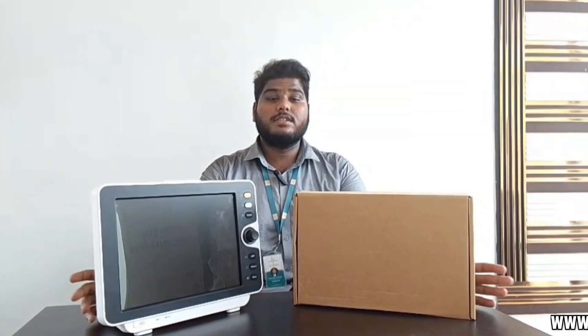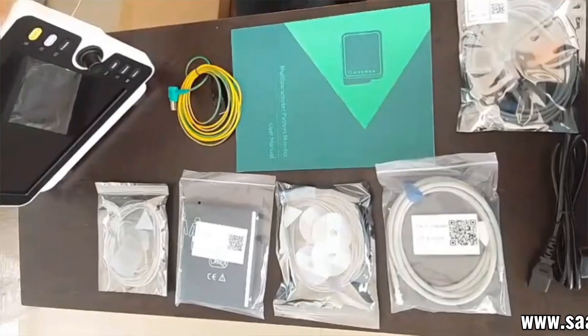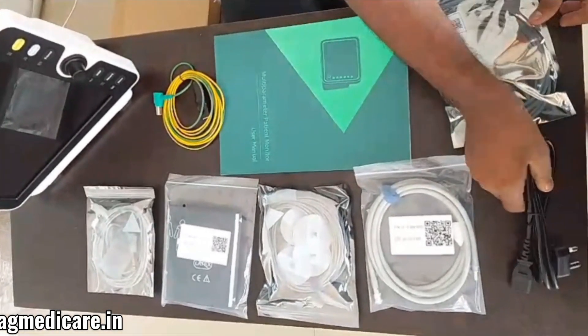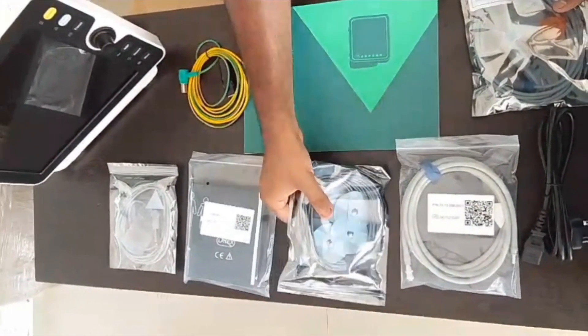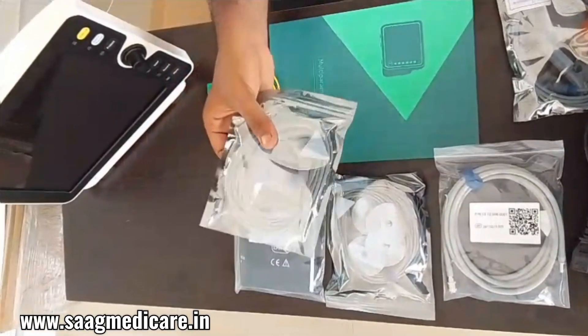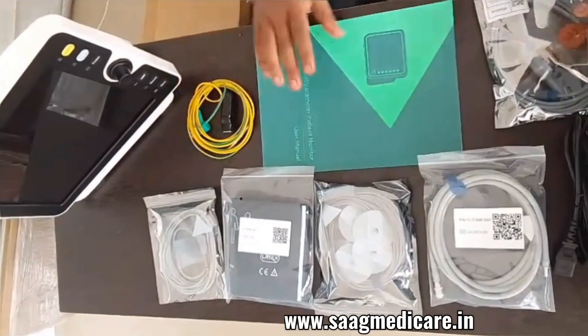Without any further delay, let's move on to unboxing and we can see the device specifications. This device comes with an SPO2 sensor, a power cord, an ABP cable, ECG cable along with electrodes, an ABP cuff, a temperature sensor, an earthing cable, and user manual.